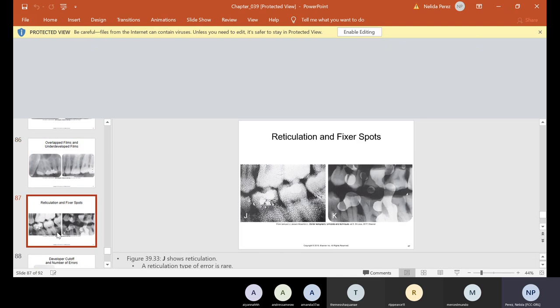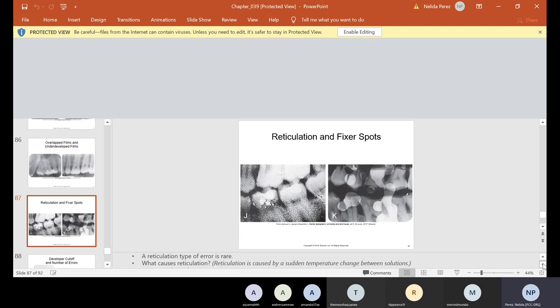Both of these films are bite-wings showing reticulation and fixer spots. Reticulation is a very rare error caused by a sudden temperature change between solutions — like ice cubes in hot coffee. If you had to add water to the concentrate and used one too hot and the other too cold, when the film processed through it, it did this and totally ruined the film. The other problem is fixer spots: fixer splattered somewhere in the darkroom and came in contact with the film. Both of these would definitely need to be retaken.